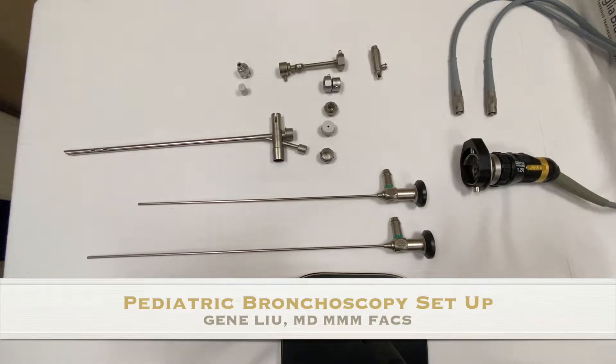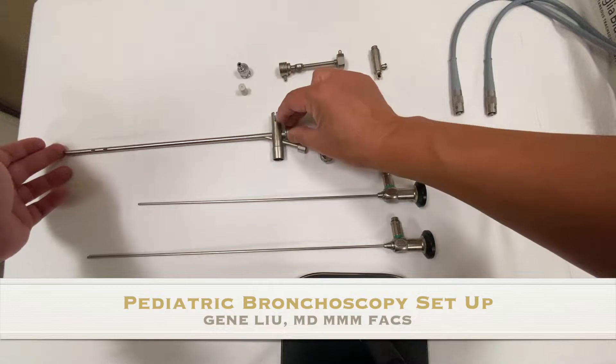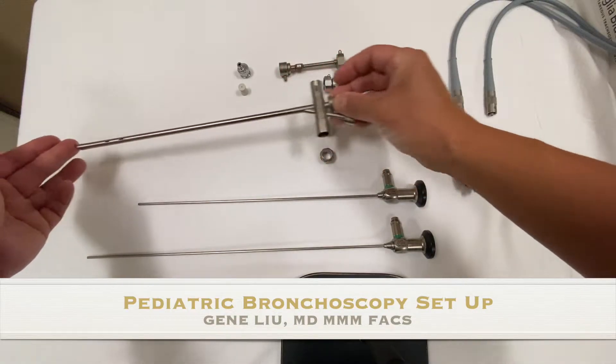Here are all the different pieces that you need to perform a bronchoscopy in a pediatric patient. The first piece is the bronchoscope itself.